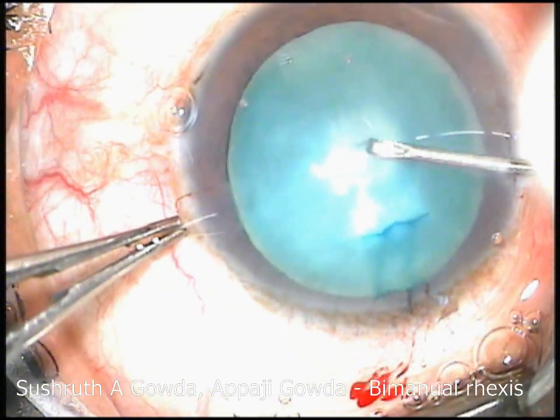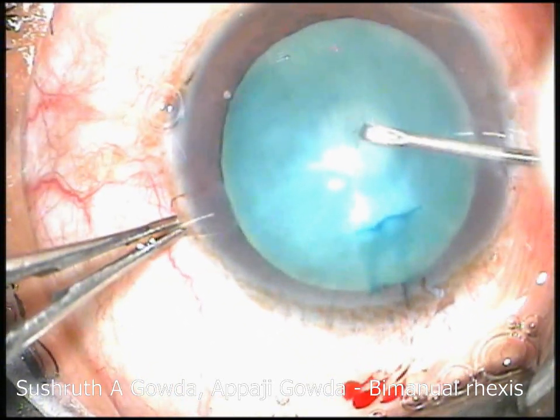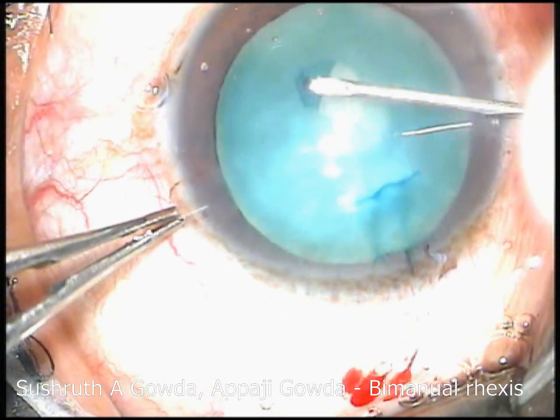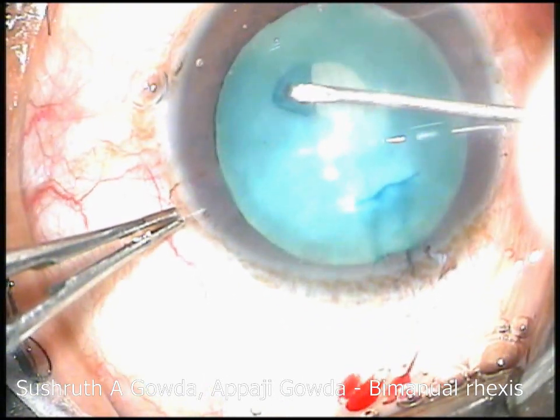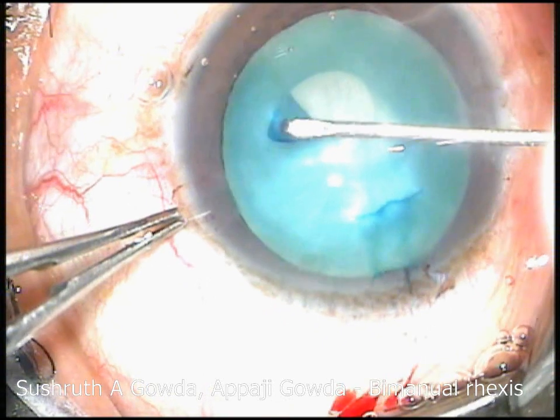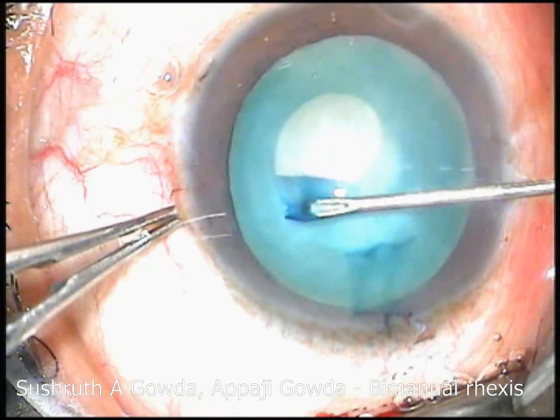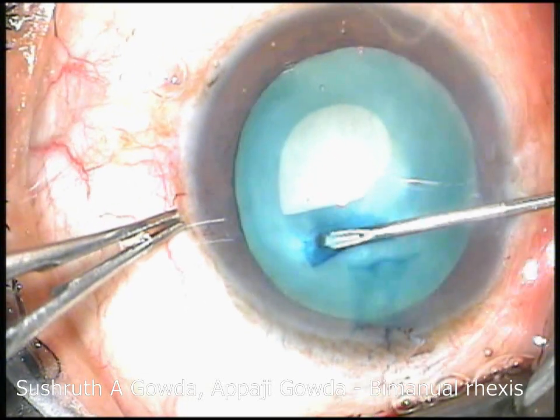In mature cataracts, intumescent and total white cataracts, because of the soft liquid cortex, there is a tendency for the shearing margin to run off to the periphery because of inadequate support. Needle Rhexis is quite a challenge because it is very thin and fragile, and we can even have punctures.